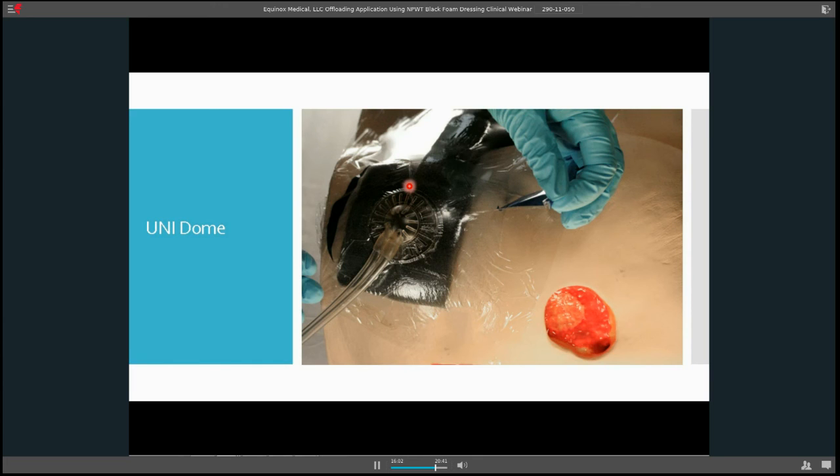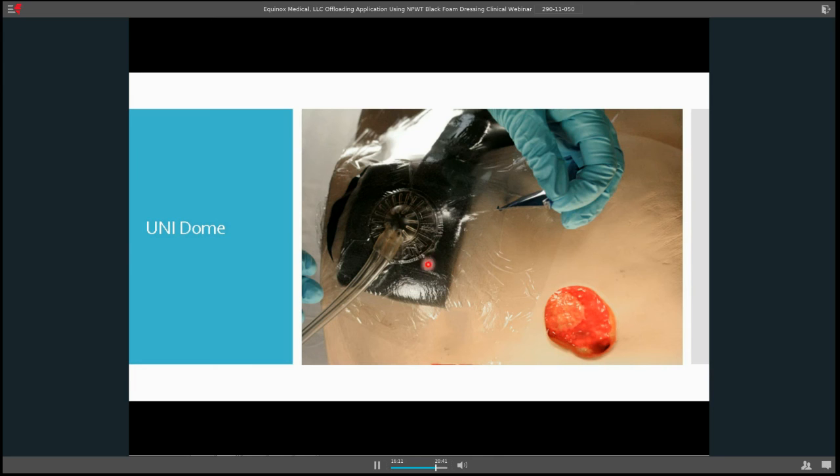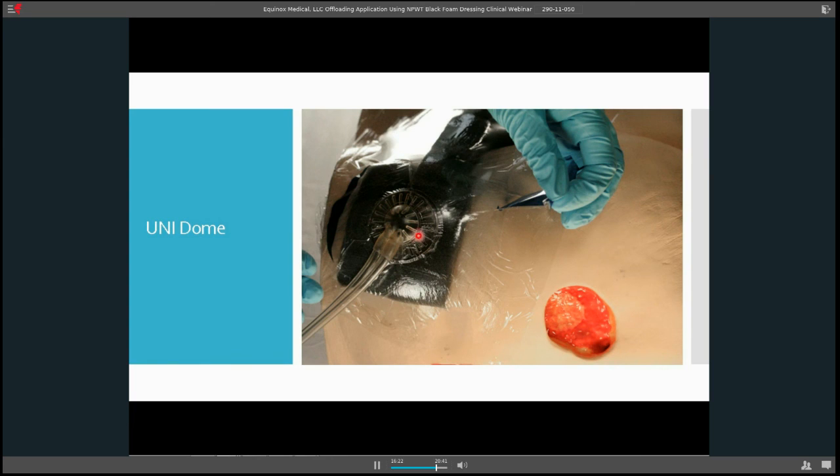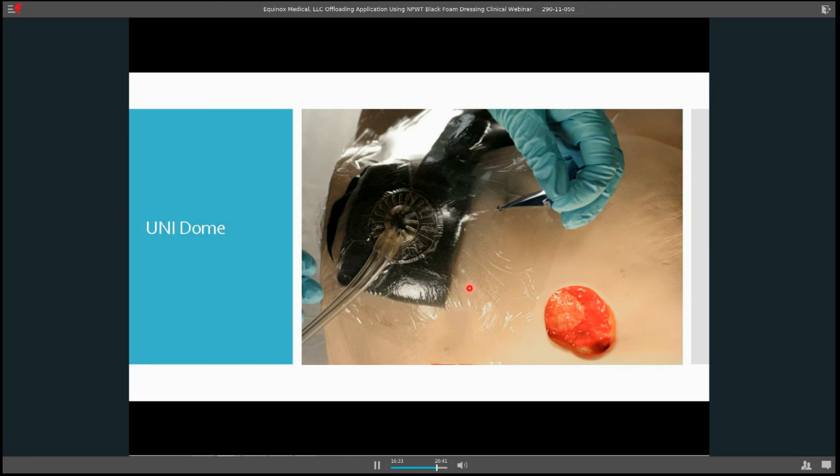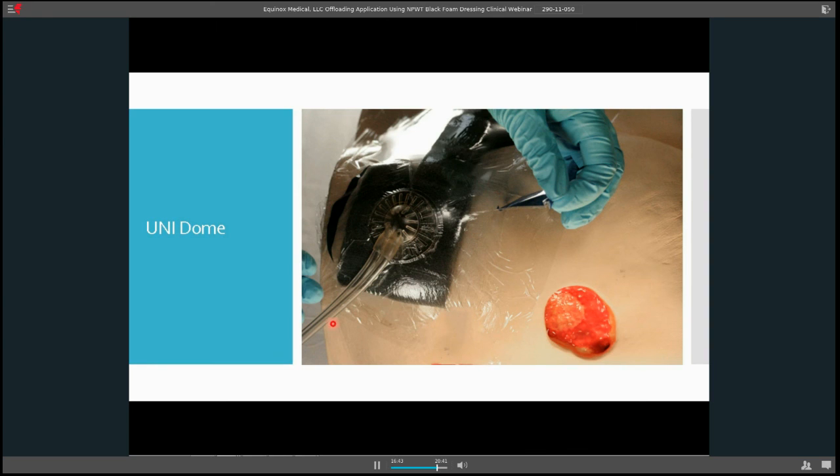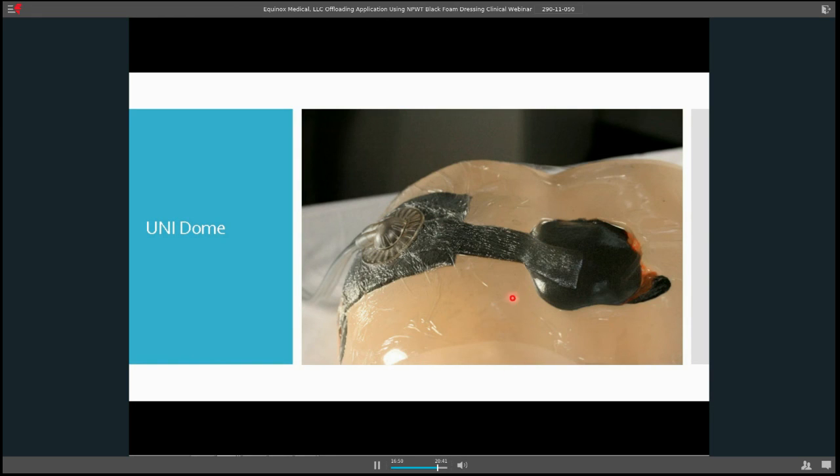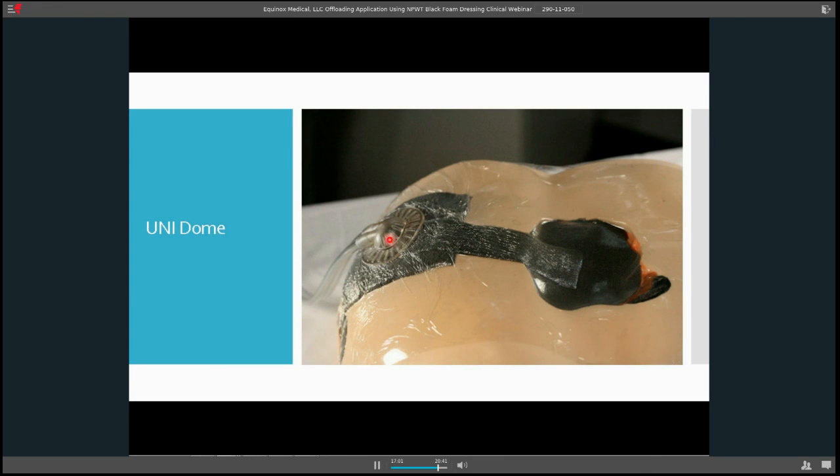This is what you end up with. Take my blue tabs off. That blue tab and that blue tab should come right off. Now the important thing here is very well-intentioned people want to make sure that this lasts 72 hours. So they take another piece of drape and they start draping all over here. Then you end up getting alarms that might say closed system. There has to be a certain amount of air permeability through this for it to work properly. Otherwise, you're not actually getting any flow of air. However, the most important thing to do is to anchor your tubing. If for some reason you look around and you think you might have a leak over here, you can put a little extra drape. But the idea is one layer of drape is probably the best scenario, unless you're in a very difficult spot and you're just trying to make sure that you have a good seal. Of course, we would have trimmed back and not had so much drape if we were working on a person.